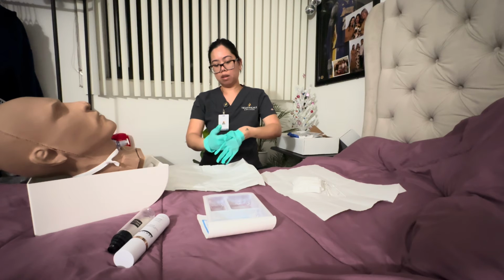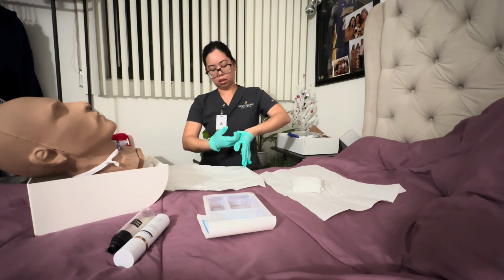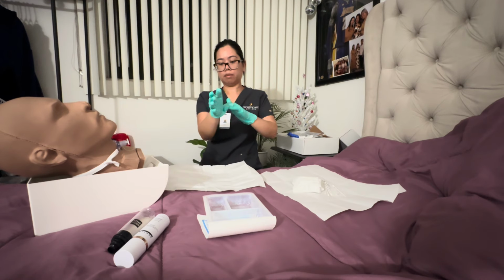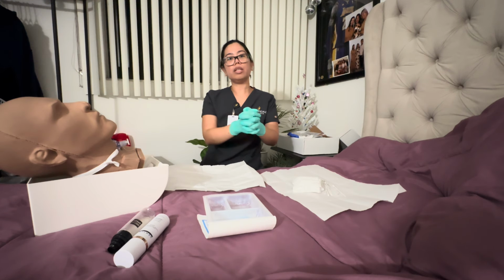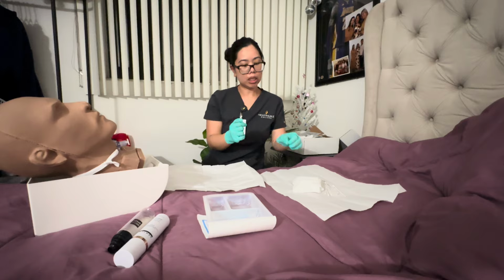Okay, it's the same thing for this one. Just be careful not to roll the back. Okay, just gotta keep the hands above the waist with the sterile gloves. I'm gonna go ahead and reorganize my kit.